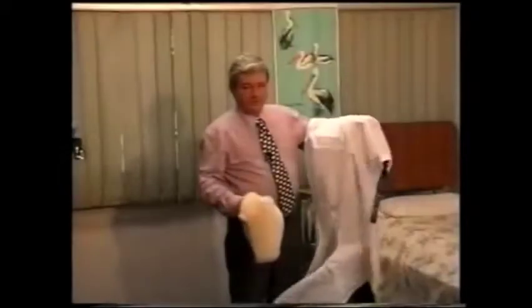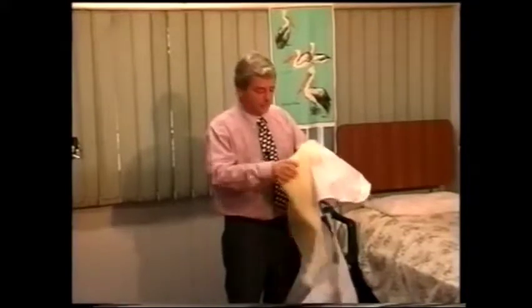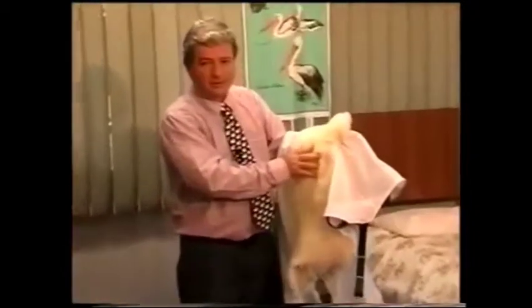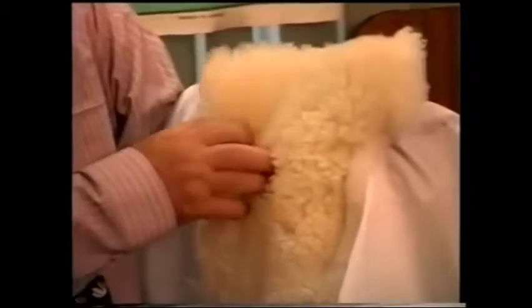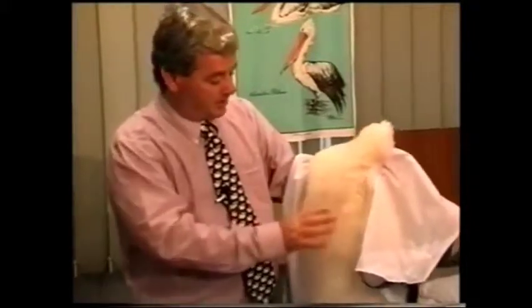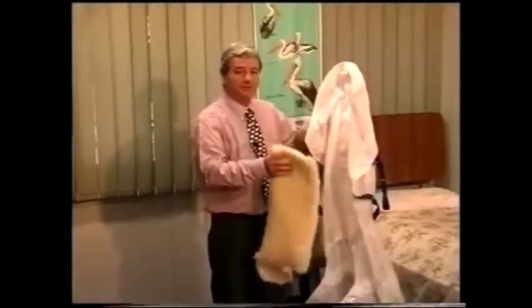Right. One of the things that we've done, not too often, but it is not an unusual request, is to put a woolen lining inside the sling. Can you just come in here, James? And this has been very good for people who've got fragile skin. This wool material, which is a genuine sheep's wool on a knitted background, is specially made for medical use, so you can wash it without the problems associated with sheepskin. We normally use this for heel pads, elbow pads, pressure care items, bed pads, etc. But we can line the inside of the sling with the wool, which for some people who've got very delicate skin, that has been a nice thing for them.